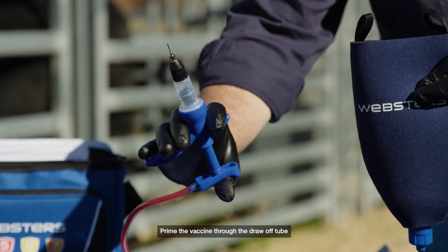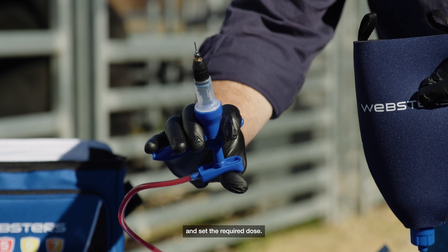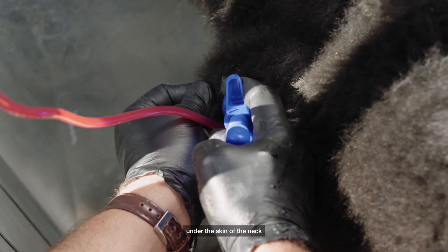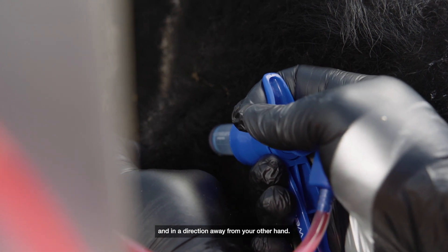Prime the vaccine through the draw-off tube in an upright position until the chamber is full and set the required dose. During the application, tent the skin and inject the vaccine under the skin of the neck with the applicator at a 45-degree angle and in a direction away from your other hand.